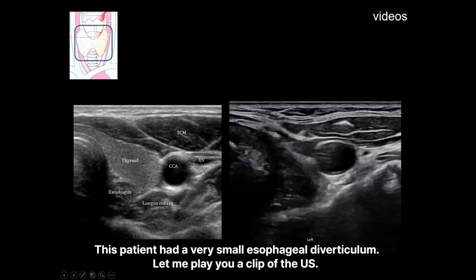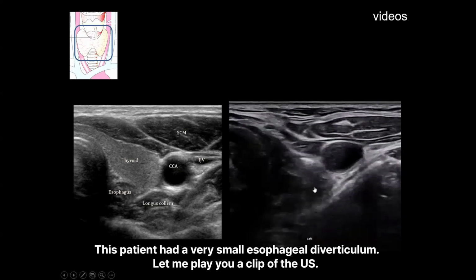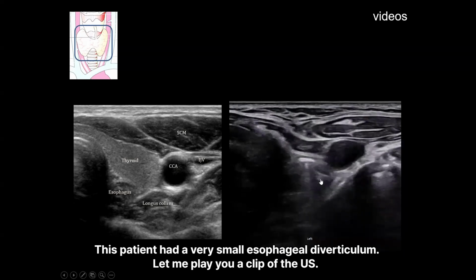This patient had a very small esophageal diverticulum. Let me play you a clip of the US.